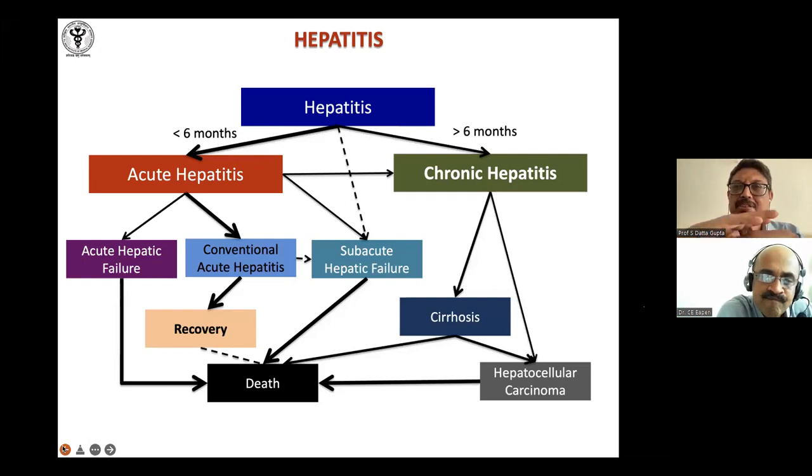In a liver biopsy, first you see under low power, we scan the entire slide. Then we begin seeing. There is no hard and fast rule whether you start from the terminal hepatic venule end or you start from the portal end. Usually, because most of the time this is done for hepatitis, many start from the portal tract end and go to the terminal hepatic vein. Others, for example, if it's Budd-Chiari or most of the changes are from the central area, you can start from the central and then go gradually.